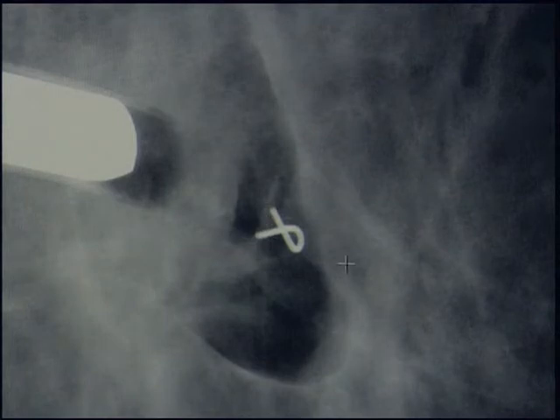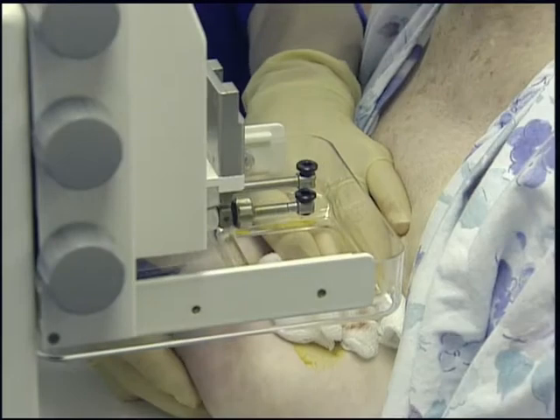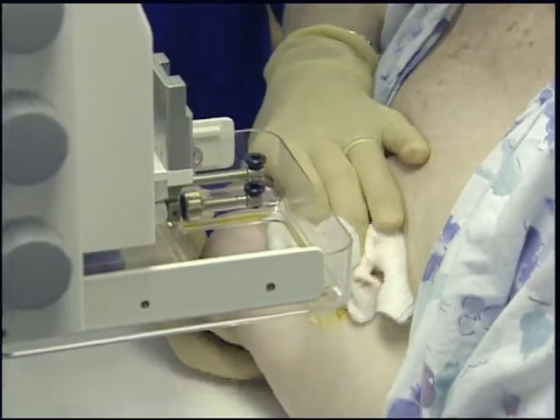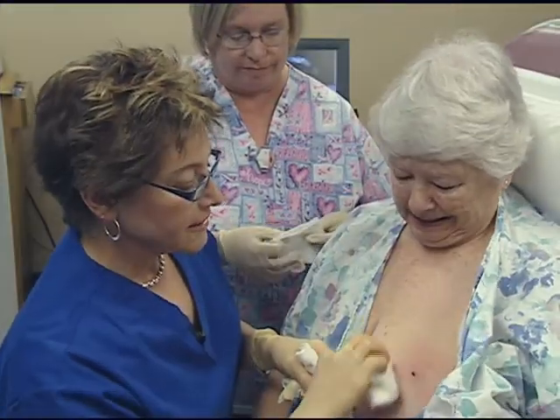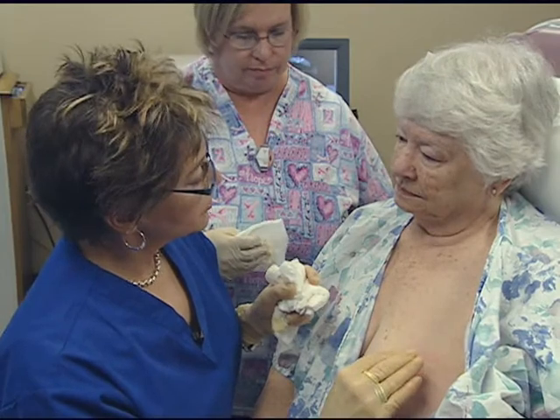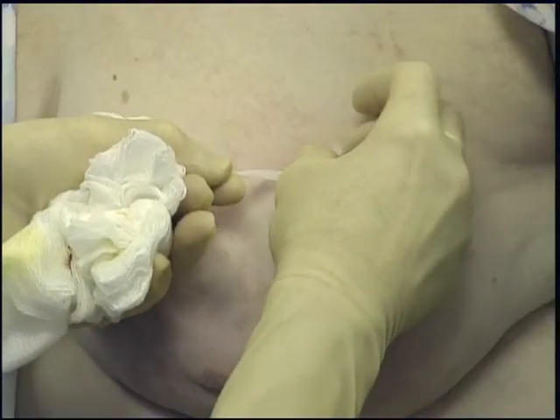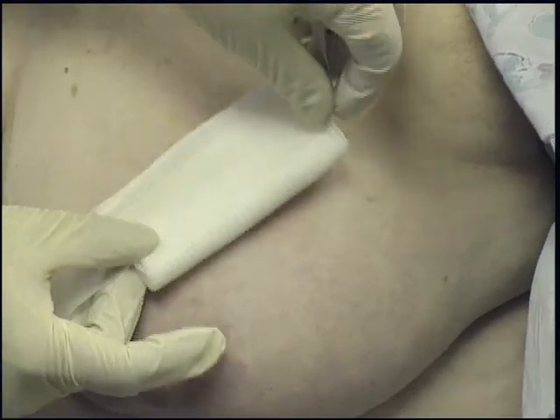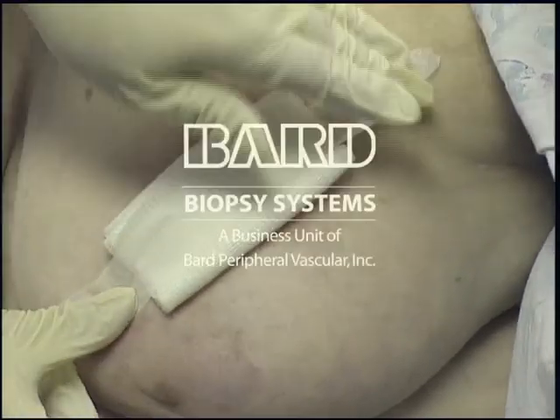You can see this comes in three different shapes — this is the survivor ribbon shape. It's a pretty quick procedure. We're going to put a small pressure dressing over the SteriStrip. You can shower tomorrow and all you have to do is remove the pressure dressing and shower right over the SteriStrip.